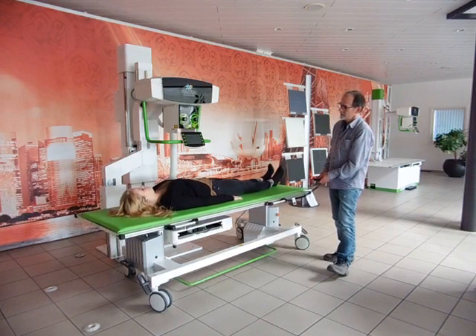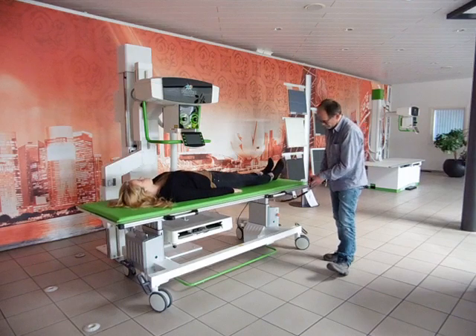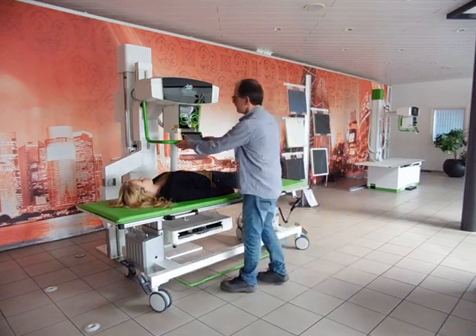The height of the table can be adjusted with the attached remote control, and of course you must adjust the bucky close to the table.